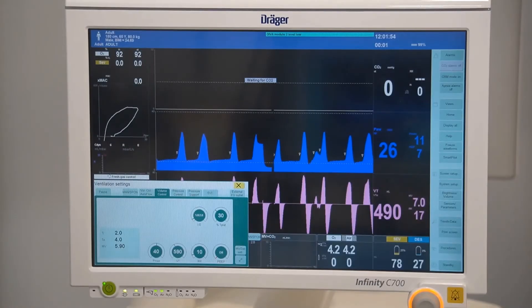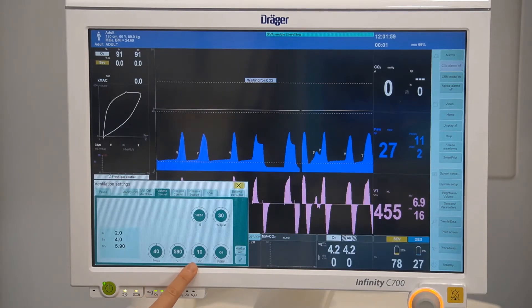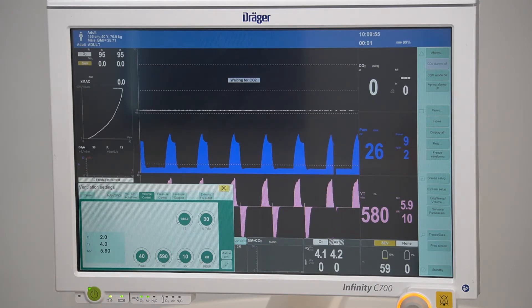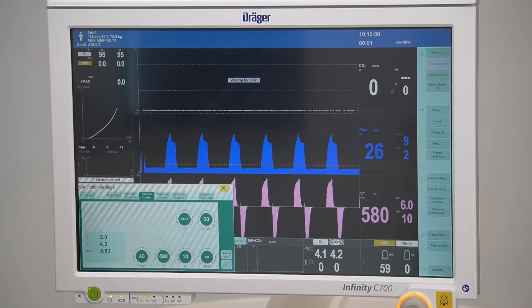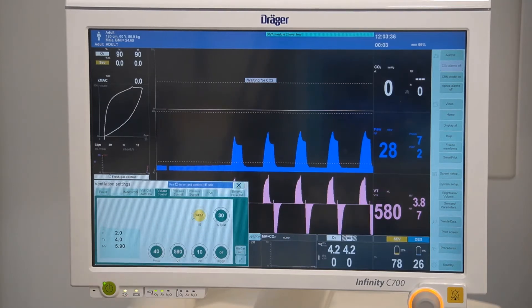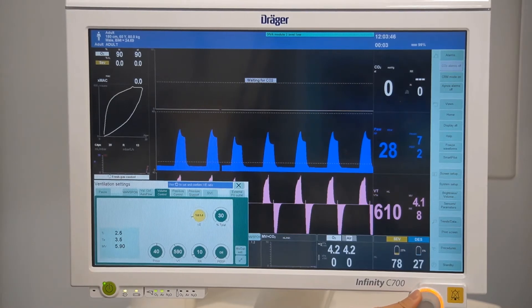In volume control mode you have the ability to set a tidal volume and a frequency. P max limits the inspiratory pressure. If the set volume is not reached because the pressure is limited by the P max setting, a corresponding alarm will appear. To adjust your I:E ratio, highlight the parameter and using the rotary knob make your selection. On the side you'll be able to see the inspiratory and expiratory times as you make your adjustment.